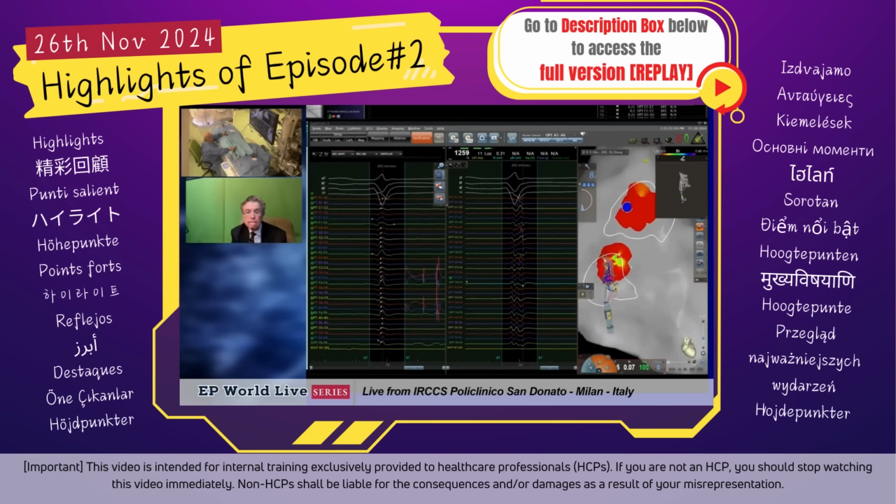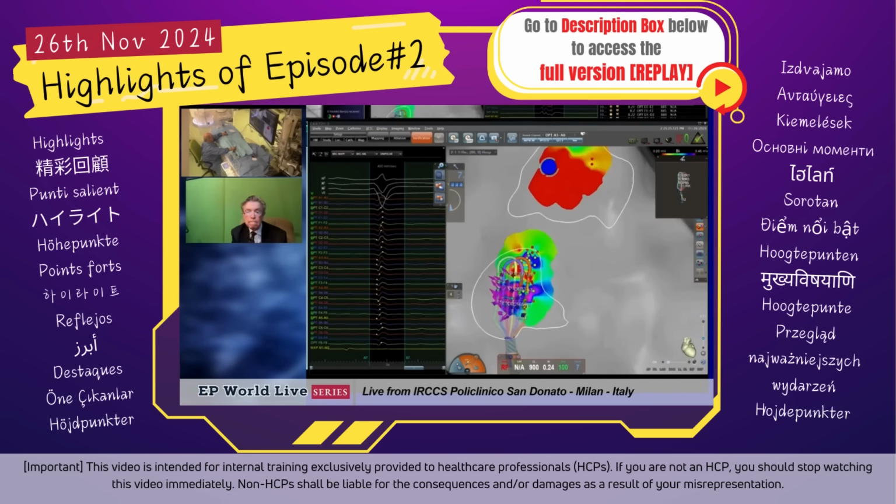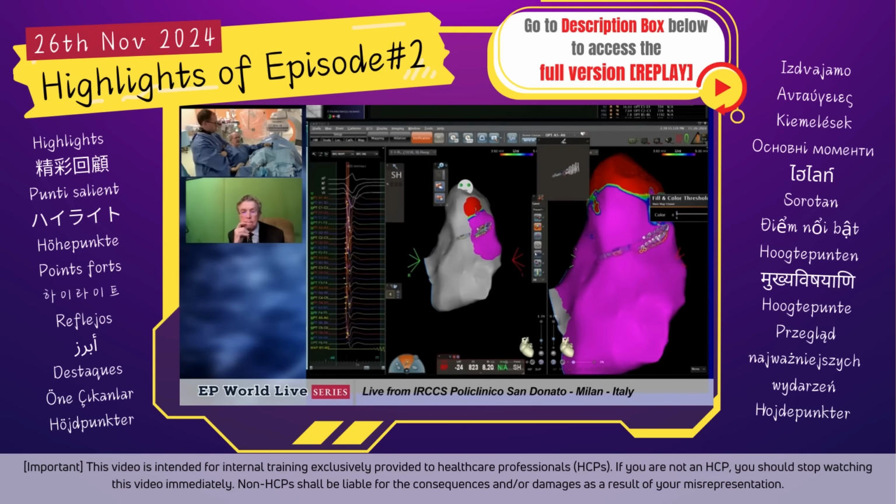We still have potential, but not double potential. See? It is homogeneous. See? Double potential before, single potential after. Okay. I think we did finish the procedure.